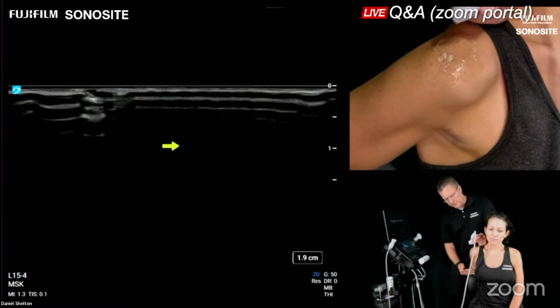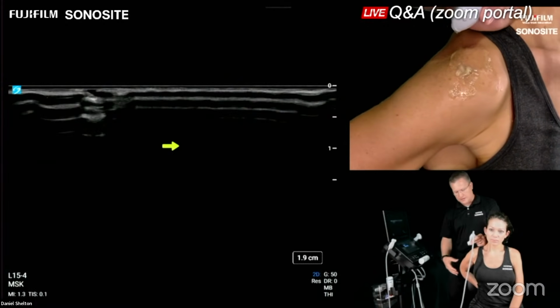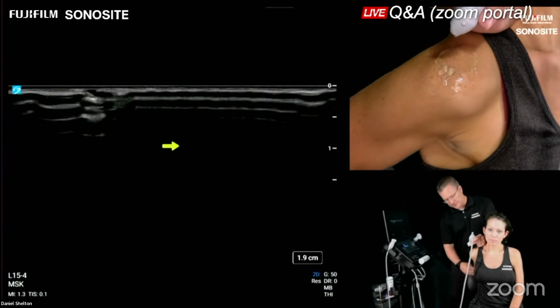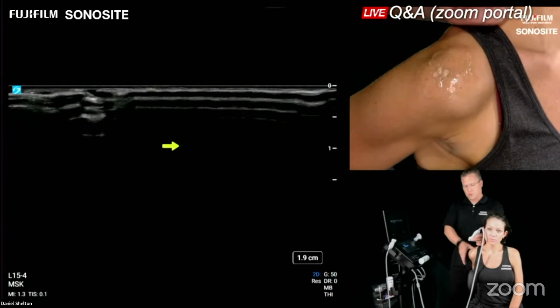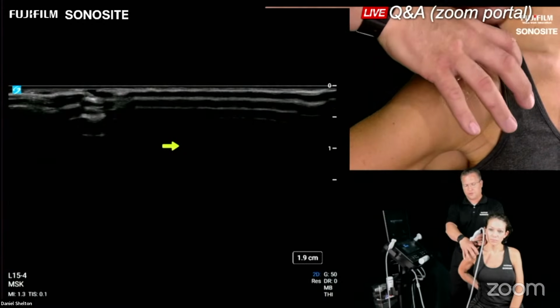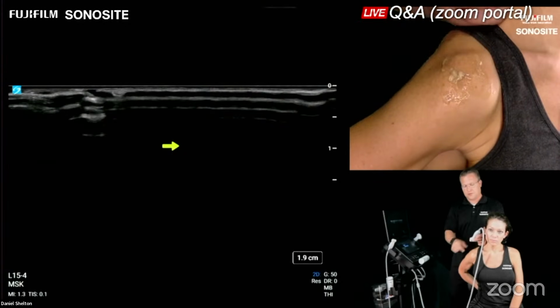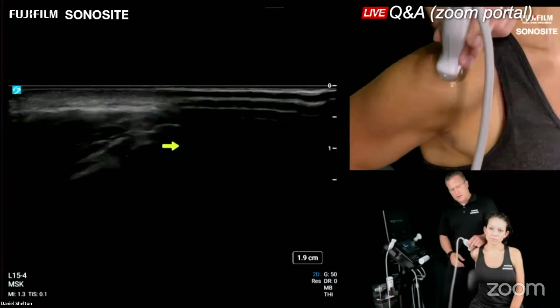In modified CRAS, it's really important not to chicken wing out here. If you can get an arm through here, that's bad. If you can come up here and see that gap has closed quite a bit, it's going to bring the rotator cuff structures lateral, and when we're internally rotated, when we chicken wing out like that, the cuff structures go in and under the coracoid process, so I'm not able to see them. So you have to externally rotate the shoulder in this position.